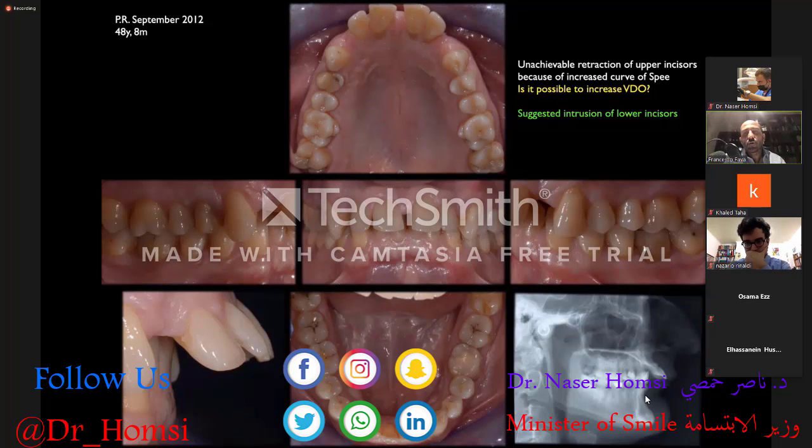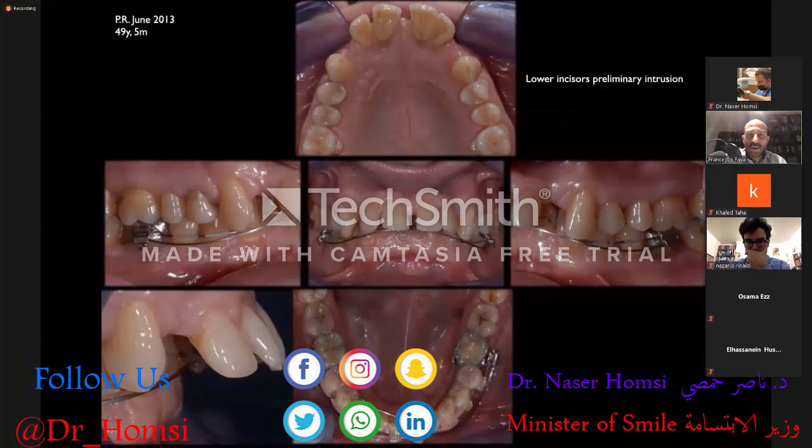We know that to obtain a pure intrusion of the lower incisors is quite hard with a continuous arch wire for two reasons. First, the intrusion forces act buccal to the center of resistance of the lower incisors, and this creates a tendency for the incisors to flare. The second reason is that working with a continuous arch wire, it is very hard to create the exact, very light amount of force indicated for pure incisor intrusion. This is the reason why we decided to use, in this case, the segmentary technique in order to obtain a preliminary intrusion of the lower incisors.